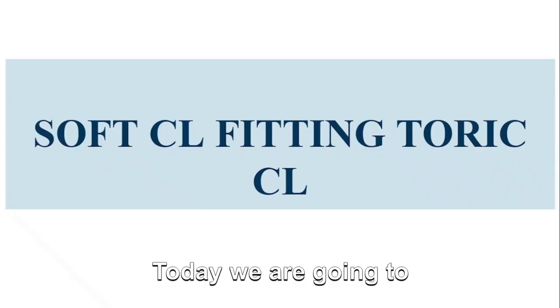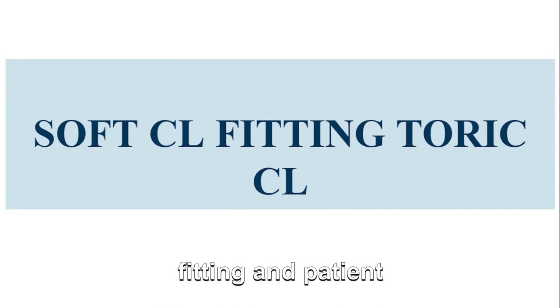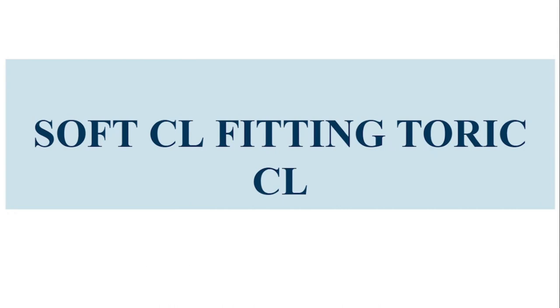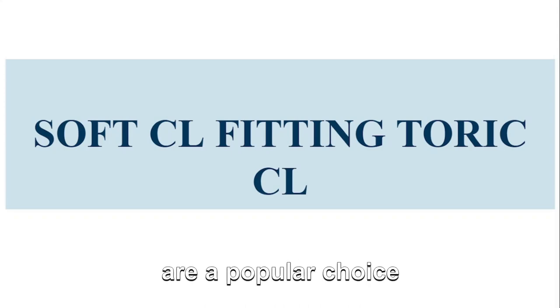Today we are going to talk about contact lens fitting and patient screening. Today we are going to talk about soft contact lens fitting. Soft contact lenses, also known as hydrophilic, hydrogel, gel, flexible, limbal and semi-scleral or paralimbal lenses, are a popular choice for vision correction.